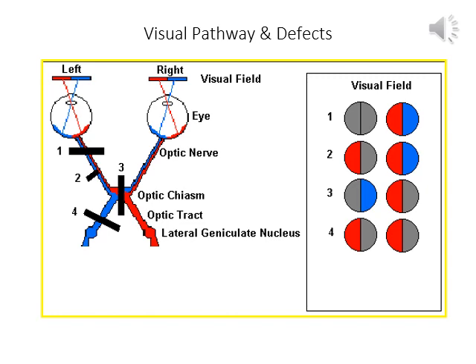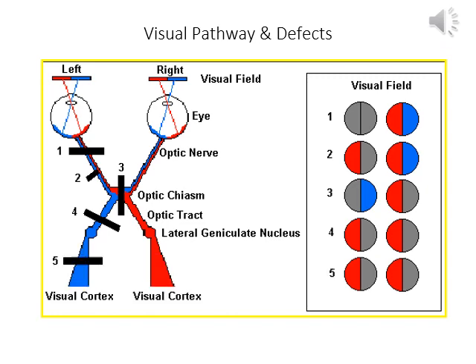And so when we look at the picture on the right, corresponding to number 4, what we see is that the red input, the inputs that come from the left visual field going to the right retinal fields of both eyes, will continue down the right optic tract, and so they are able to generate a VEP, whereas the blue parts, the right visual field, which activates the left retinal field and the information is translated to the left optic tract, cannot pass on to generate a VEP, and so those parts of the visual field are colored gray.